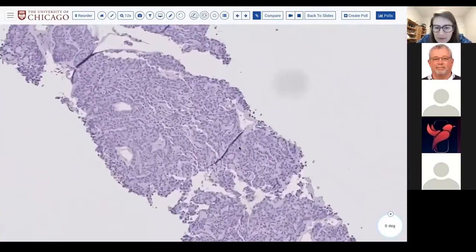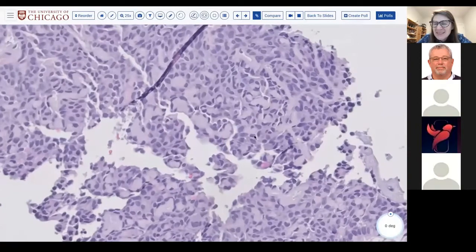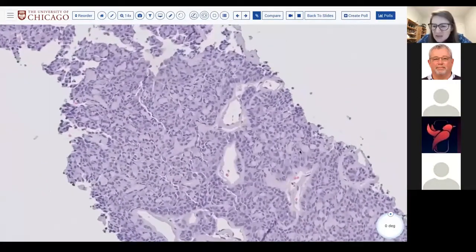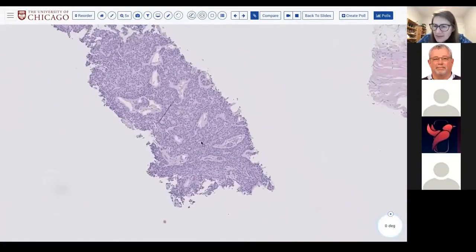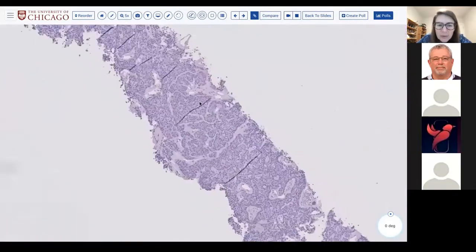Yeah, you perhaps also start to see more pale little globules. So you could start to think, well, is this cribriform space in an adenoid cystic, or what else could these little small tight globules represent? But regardless, you see a quite cellular salivary neoplasm with these little globules.